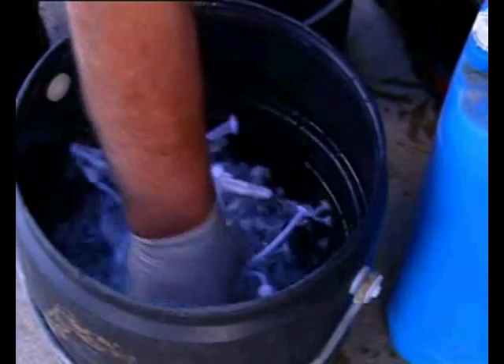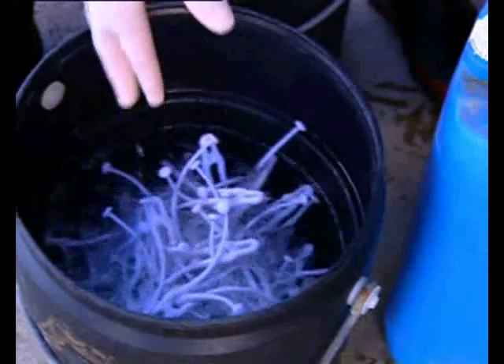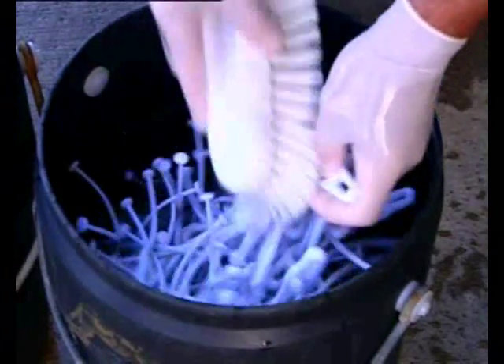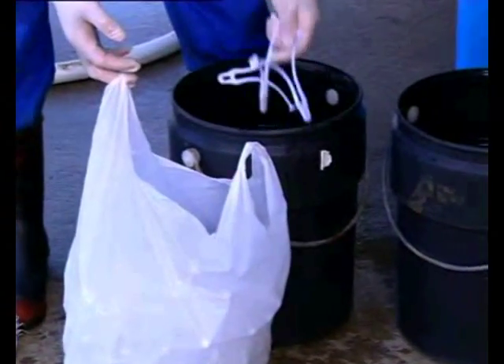Wash the wishbone in hot alkaline detergent at 65 degrees centigrade — a typical milking machine detergent is suitable. Scrub the wishbones until they are visibly clean. Dispose of any wishbones that are not surface clean or damaged. Allow to dry and store in plastic bags away from direct sunlight.